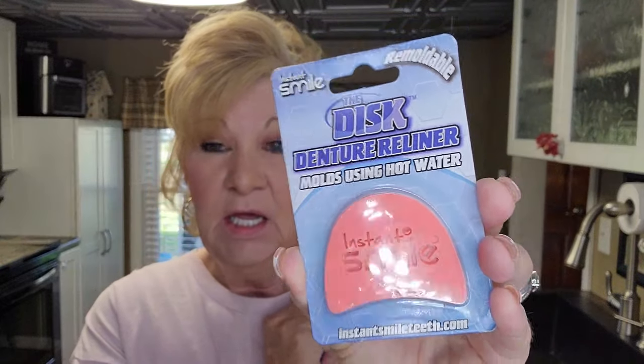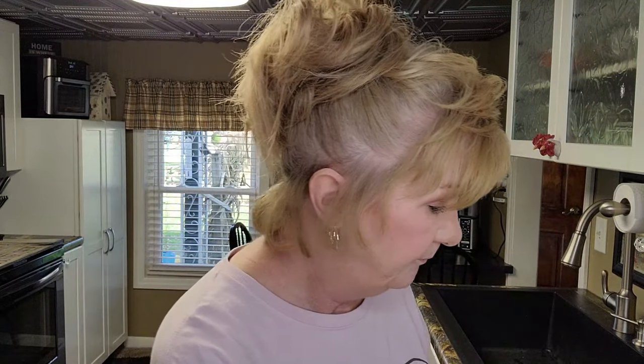All right, you ready for this? Here we go. Molds using hot water. So I've got water in my microwave right now heating up, and what you're supposed to do is put this thing in your top denture and pour the hot water on the thing, not your denture. So we're gonna do that now.